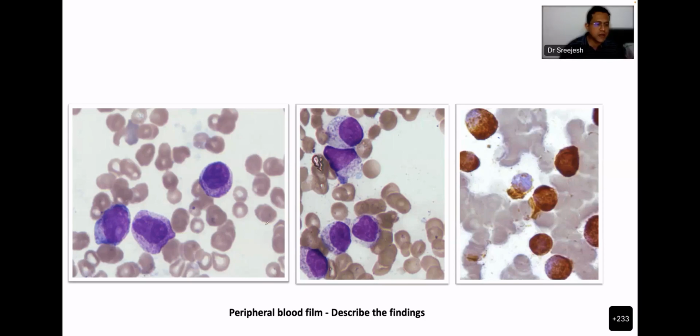Some irregularities there. As you suggested, you have granules. So you have a nucleolus, you have granules, and is the cytoplasm basophilic or eosinophilic? It's a somewhat pale basophilic cytoplasm. So if you see these cells, what will you consider? What are these cells? What do they mimic? They look like promyelocytes. Sure. Don't be biased. Anyone else?